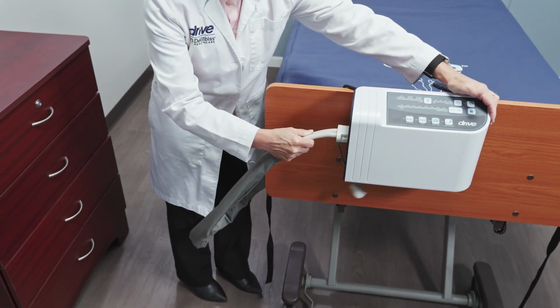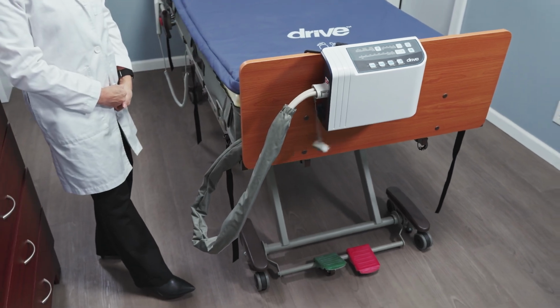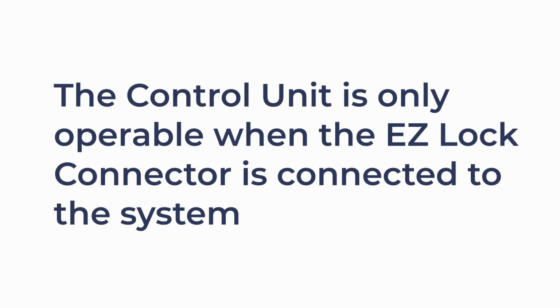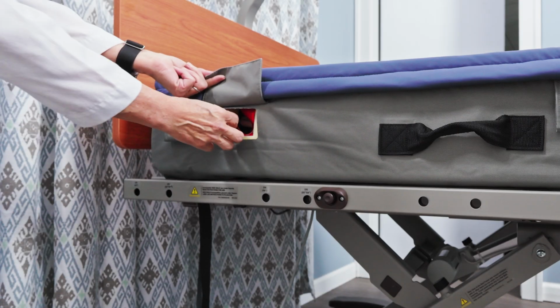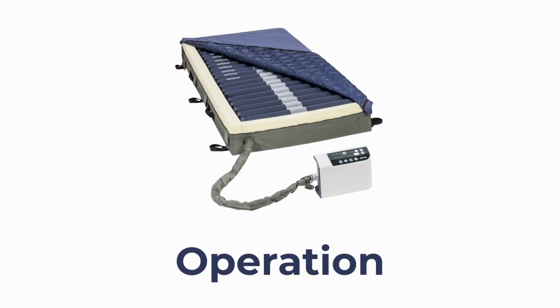Connect the Easy Lock connector from the Preserve Tech MedAire Edge air mattress to the control unit. You'll know the connector is in the right position when a click sound is felt or heard. The control unit is only operable when the Easy Lock connector is connected to the system. Check and ensure all the air hoses are not kinked or tucked under the mattress, and the CPR strap on the left side by the headboard is fully attached. That's it. Installation is done. Let's move on to operation.